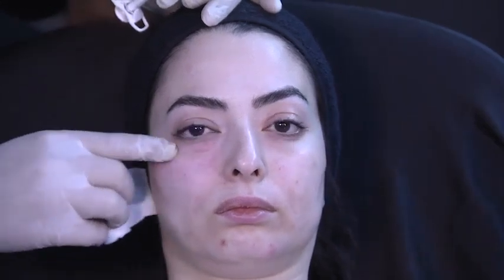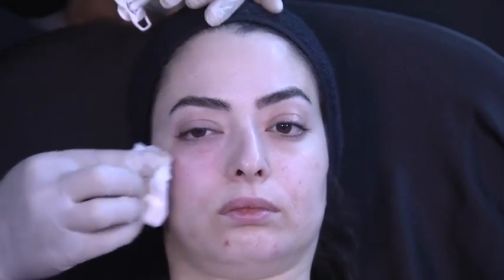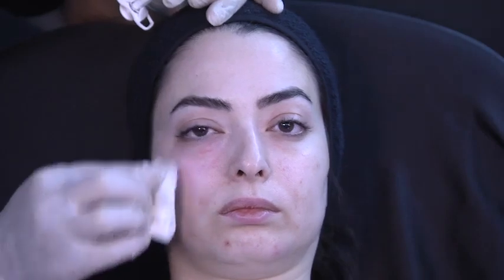And now I do my linear threading. This is Vital Light. I won't do the superficial deposit in this area, always under the muscle. I can actually go to the corner here, okay, for that sunken area, always with the resistance of the ligament. And I finish with 0.25, 0.3, just mold with a gauze.